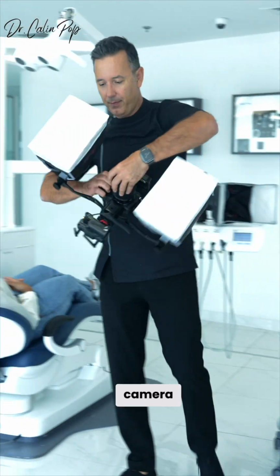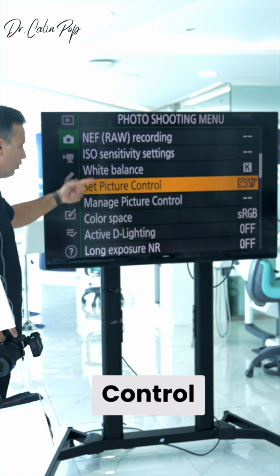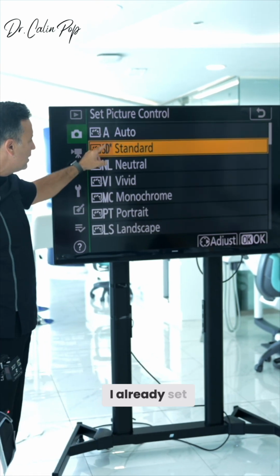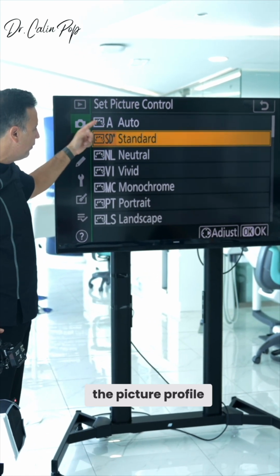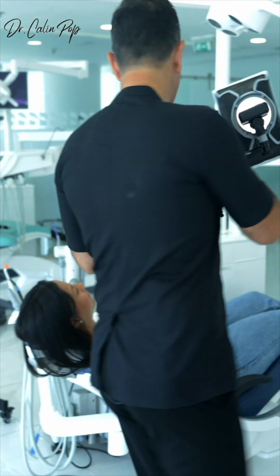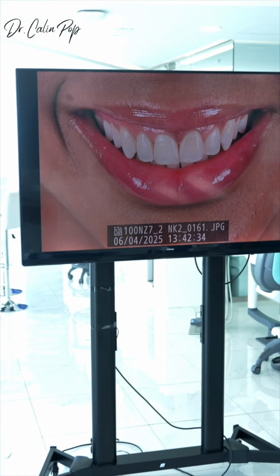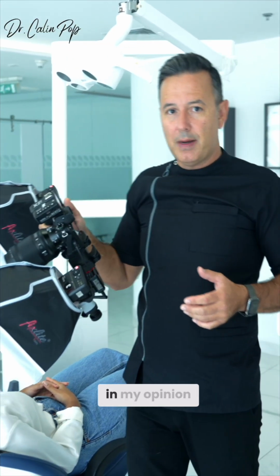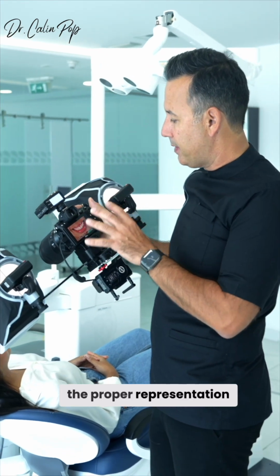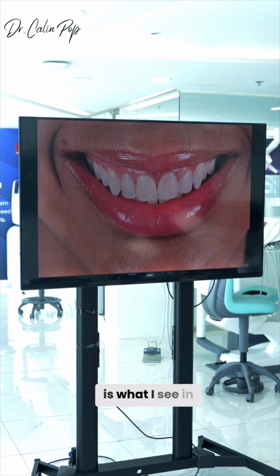So if I take my camera, if I go in the photo shooting menu, I go to set picture control because I have a Nikon camera. I already set the picture control, the picture profile, on standard, okay? So if I shoot a photo like this, I obtain a photo that, in my opinion, has the proper representation of the colors. Yeah, what I see on the screen of the camera is what I see in reality.